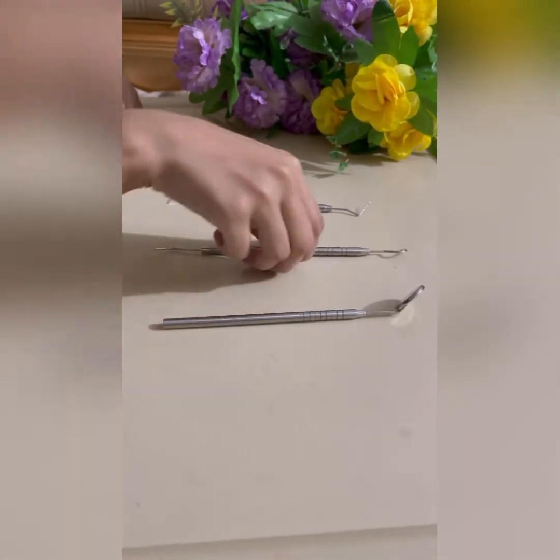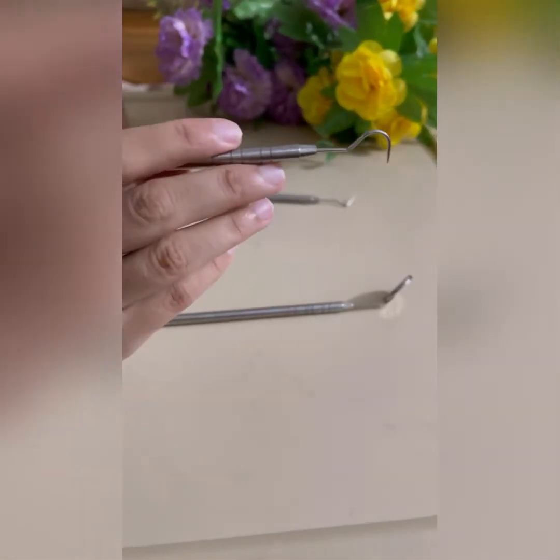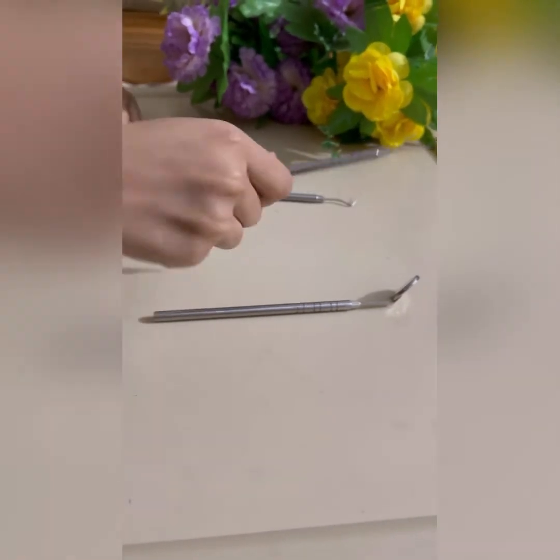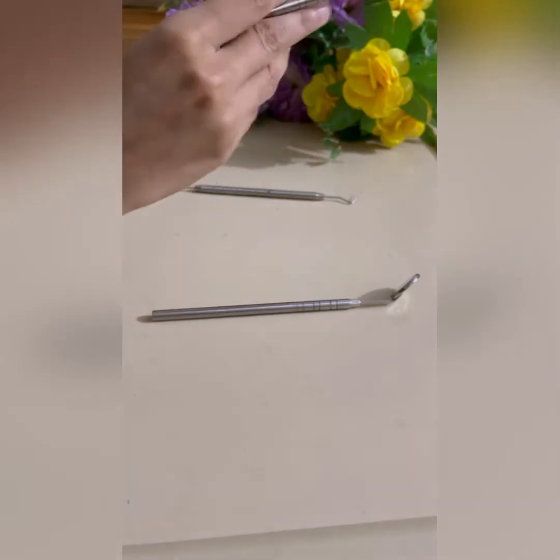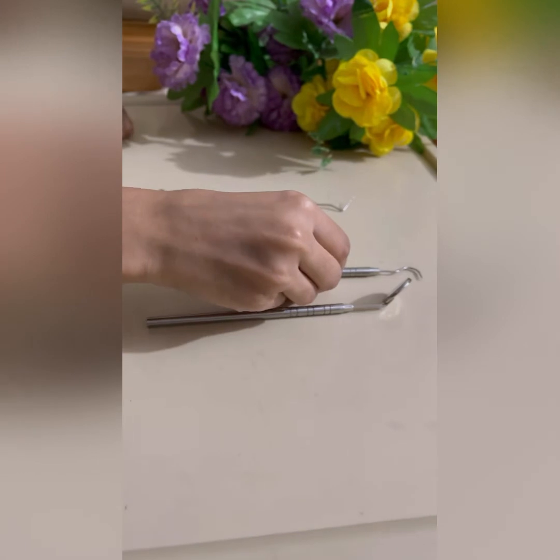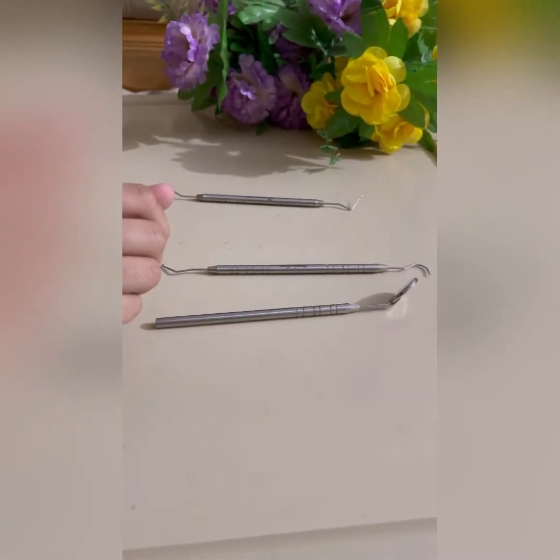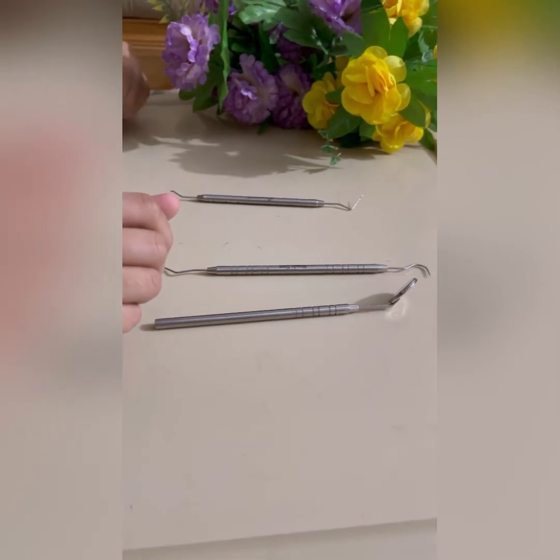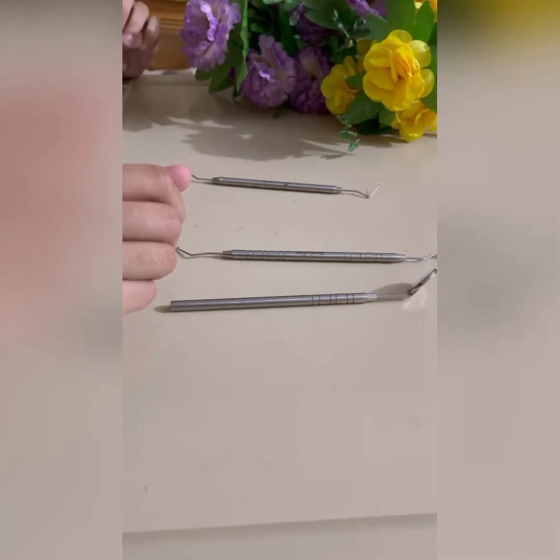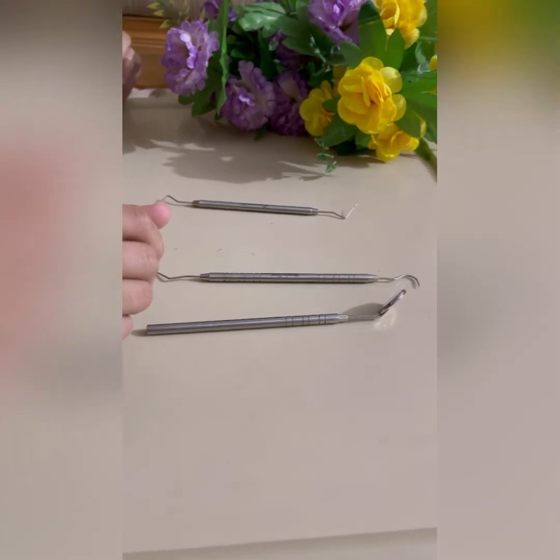Now, this is the explorer. It has two sides. The explorer is basically sickle shaped. This is used to detect tooth decay, and to check bifurcation and furcation. Furcation means branches. To check the caries region, if we apply the probe on the tooth and it moves smoothly on the surface of the tooth, it means that there is no caries region. Therefore, only the stain is present, so we will not do cavity preparation and filling.